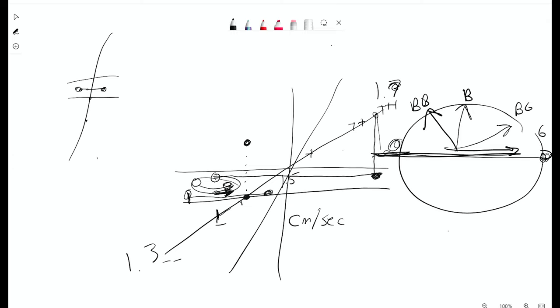And you'll notice the times where you're putting the most pressure on your gradients are diffusion sequences and CSF flow studies, and anytime I'm doing a phase contrast with slow flow like venous. Oh yeah, some cardiac sequences too. With cardiac sequences, let's say I'm doing the aorta, so I want to do 150 centimeters per second. The ramp up is not very much at all because everything's going so fast. I don't have to have a gigantic ramp up.